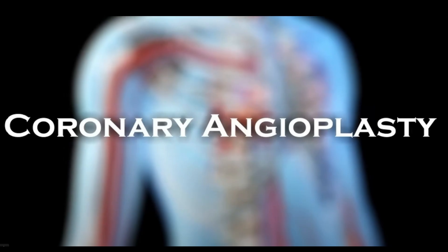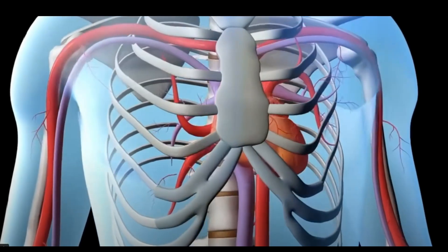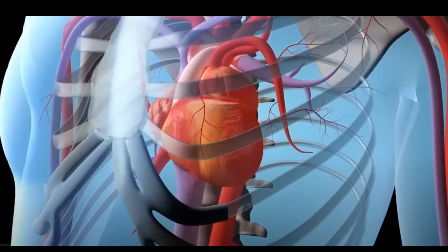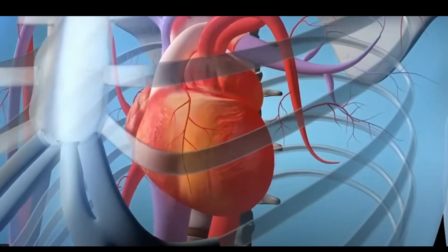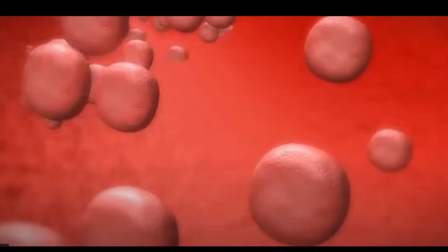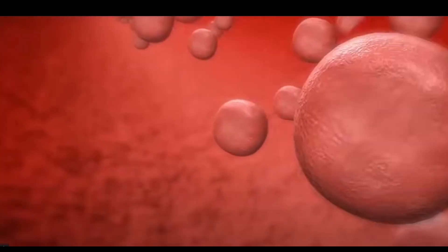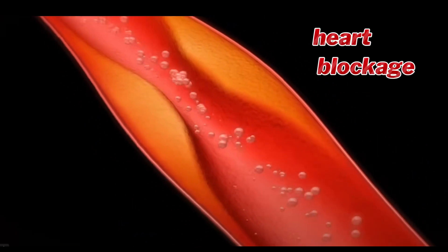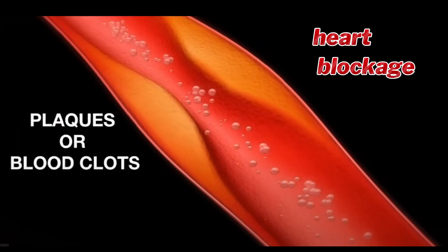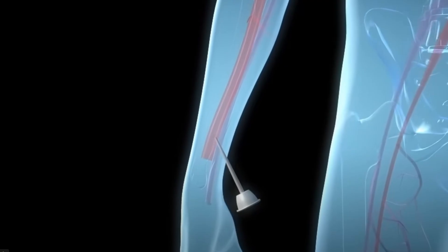Coronary angioplasty, also called percutaneous transluminal or balloon angioplasty, is a treatment procedure to restore the blood flow in the narrowed or blocked coronary arteries caused due to plaques or blood clots.